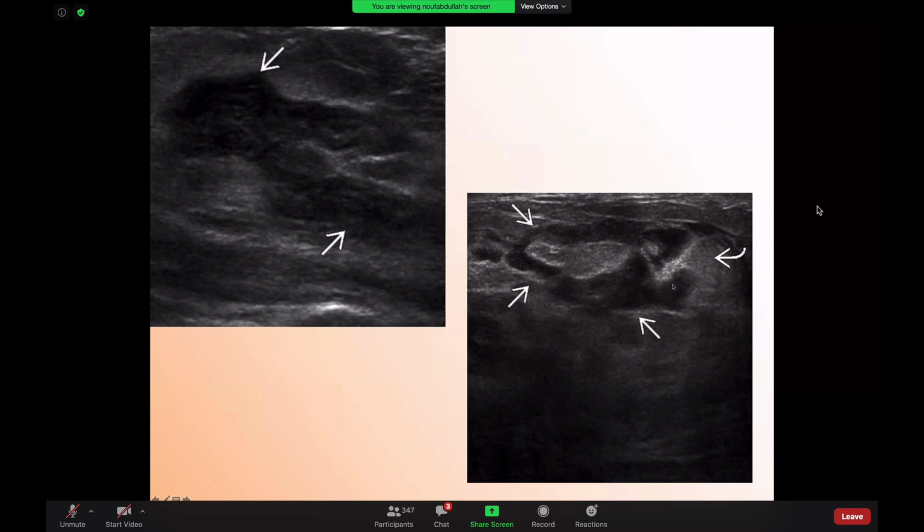The same thing here. This is just an inflamed fat. You have an inflammation with some fluid around it. So this is an area of mastitis with an abscess. So something like that, the clinical history is extremely helpful and important. So if you have a young lactating patient coming with symptoms and you have this picture, then most likely you're dealing with mastitis and abscess. You would correlate clinically. Probably you can aspirate. You can give the patient antibiotic and do follow-up in 2 to 3 weeks. But if the patient is 60 years old with something like that, you have to be careful because you might be dealing with an inflammatory breast cancer.